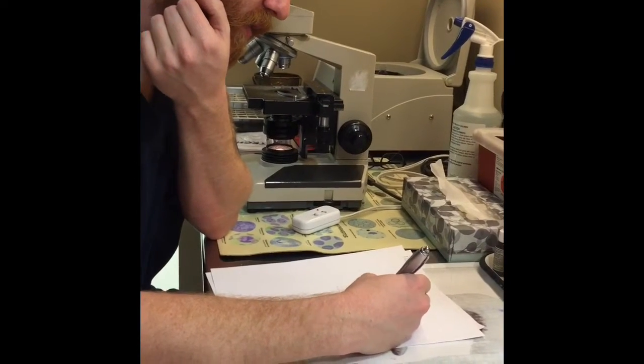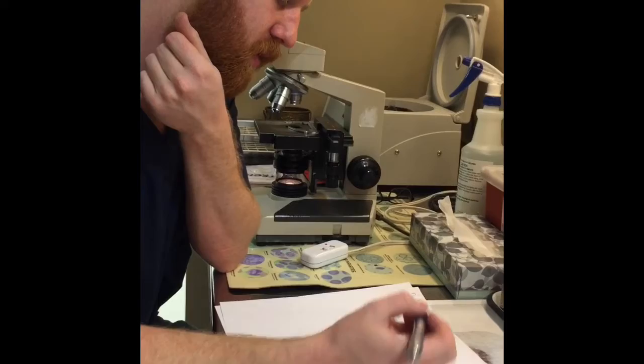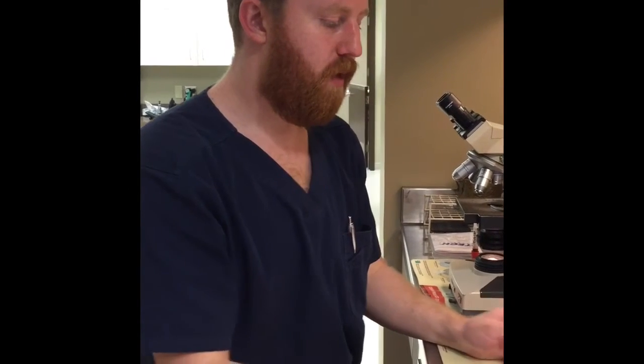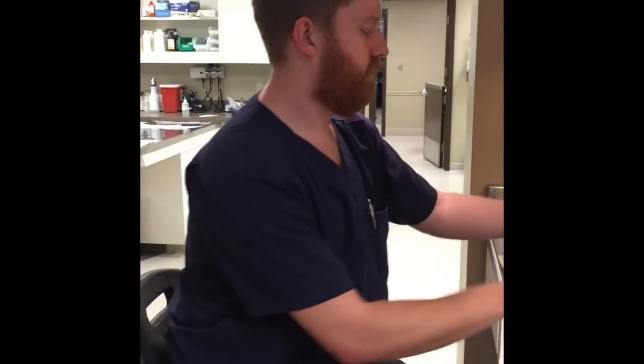I didn't see really much bacteria at all, so I'm going to put that as negative. I didn't see any sperm. He is a neutered male, and that was really all that was going on there. So, overall, pretty normal looking urine, just a little bit dilute, and other than that, everything seems to be fine. Alright, and that's how you do a complete urinalysis.